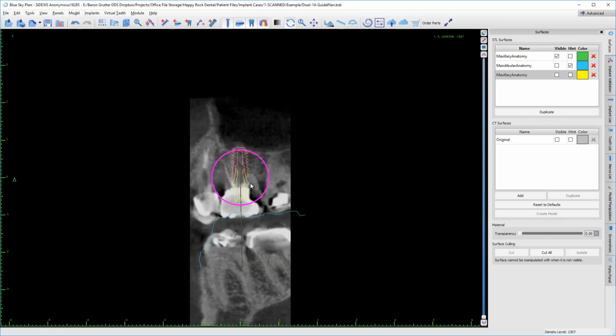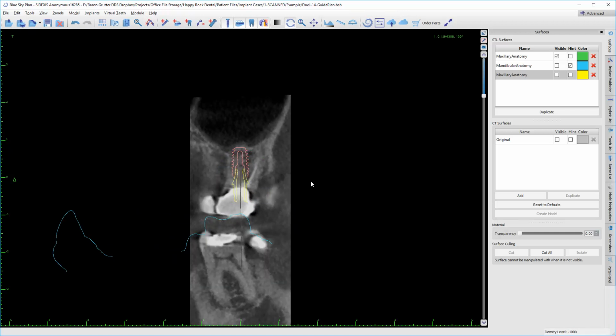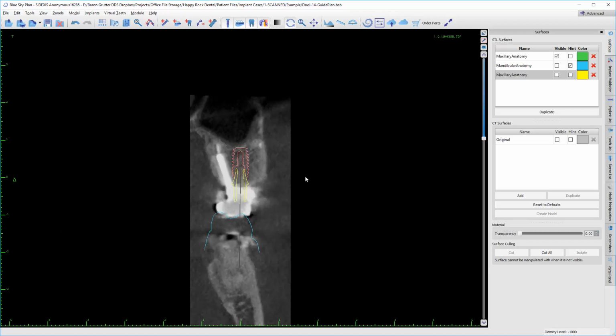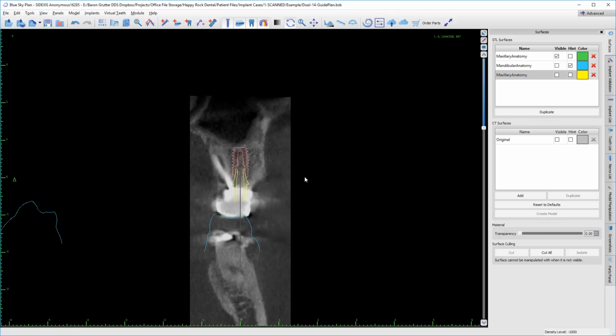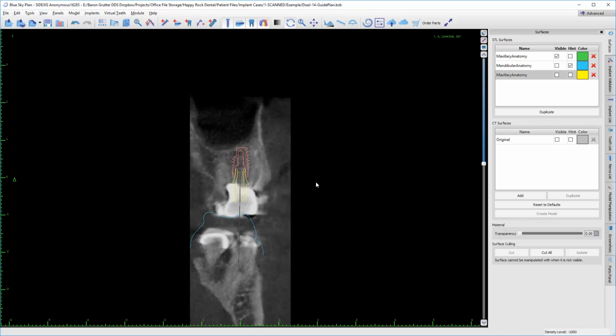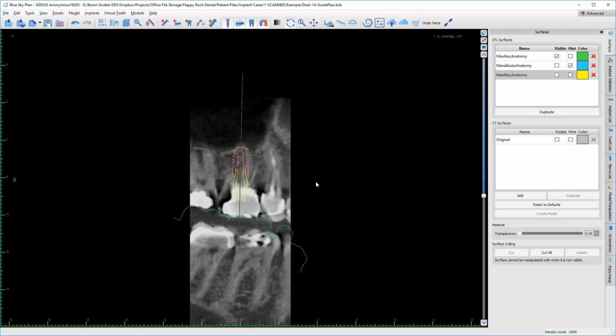This tie base gets me above the bone, whereas the implant is below the bone. That's what I'm looking for. I like to try to avoid having the ceramic of the Emax in contact with the bone if I can. But here's the bone level. We're pretty much equal buccal lingual, and we'll still graft over top of it, just bury this implant in bone.